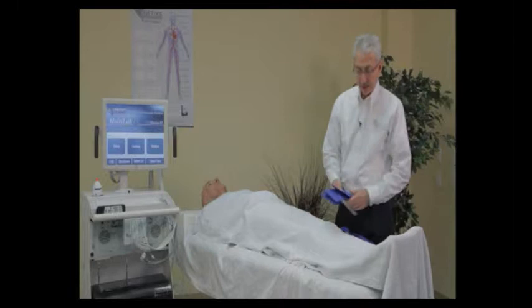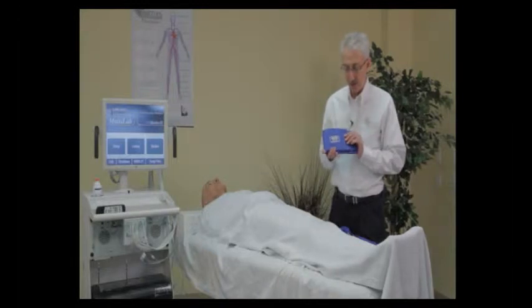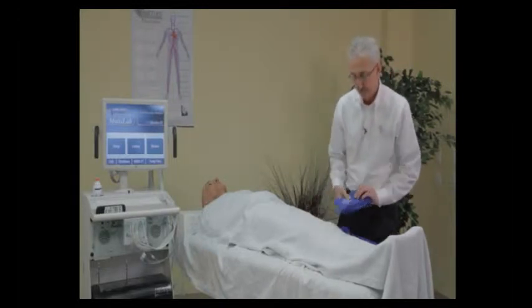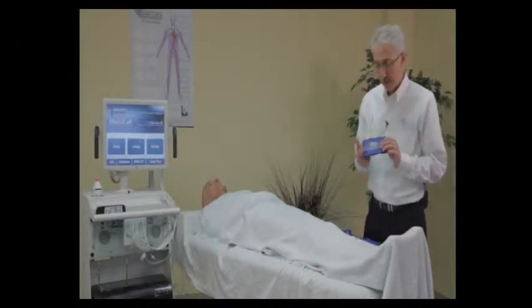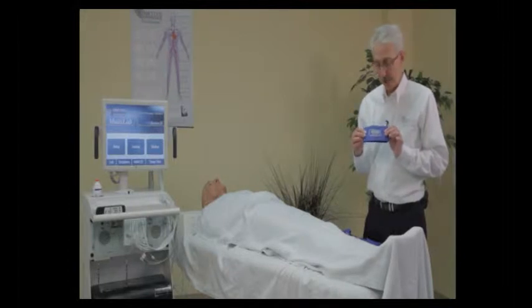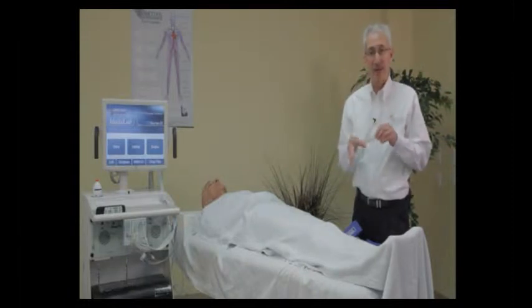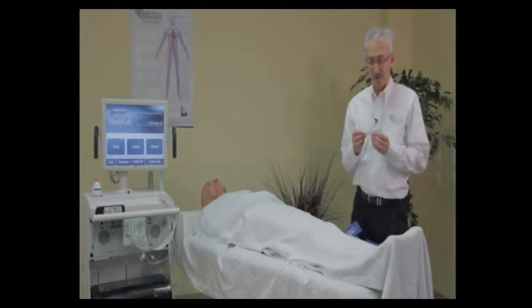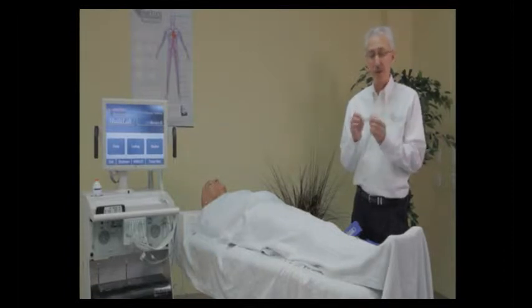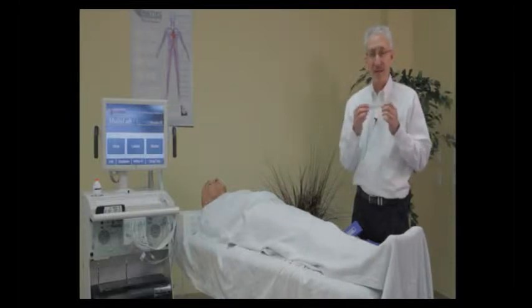Next we're going to look at the calf area. We typically use a 10 centimeter calf cuff — 10 centimeters wide — and we'll usually use that again at the ankle. Some people like to do a transmetatarsal PVR waveform, and for that application we have a 7 centimeter cuff that goes right around the mid-foot. Last but not least, we have our digit cuffs. The PC 2.5 cuff goes around the large toe. For patients with very small toes, there is a DC 1.9 cuff available.